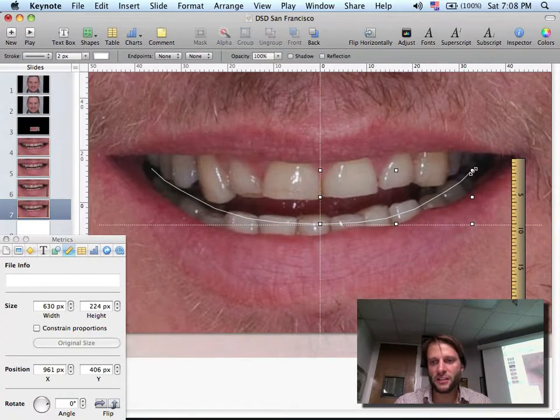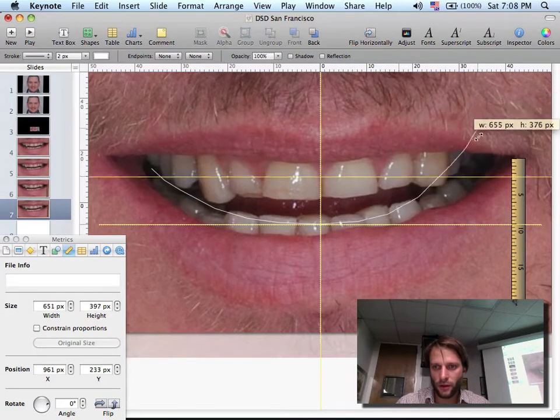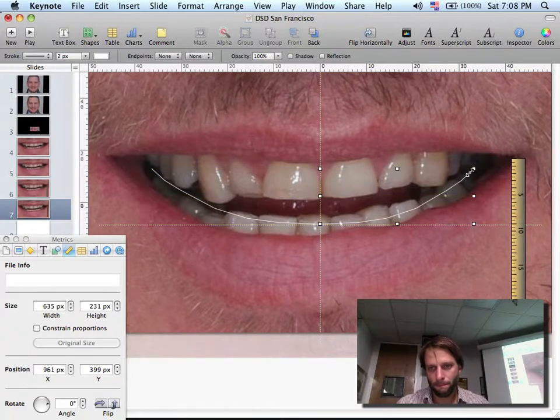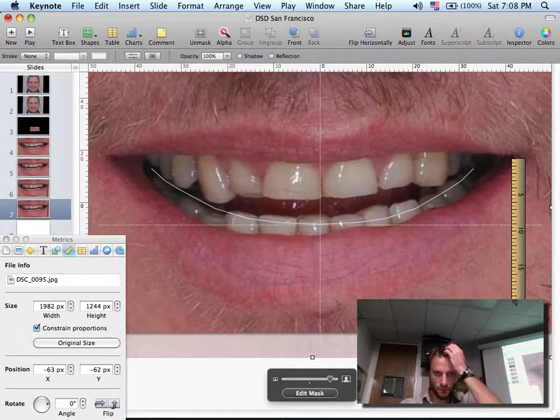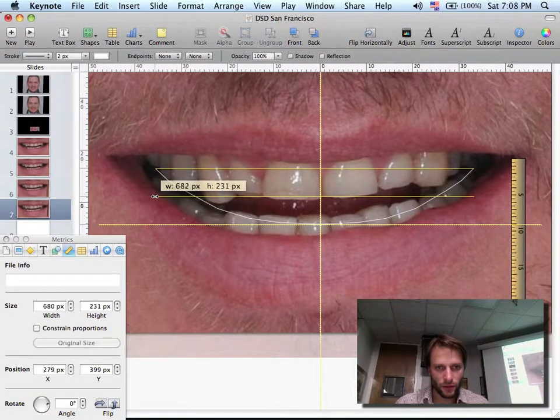The best way to change this line is to click on the line and grab the upper outer corner, this square, not this one over here, but this one, because this one gives me all these movements. I can do whatever I want. And then I will position it to a more reasonable position, somewhere here. If I want to change this one a little bit, I can also change it.